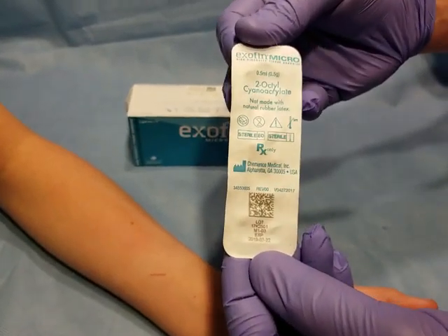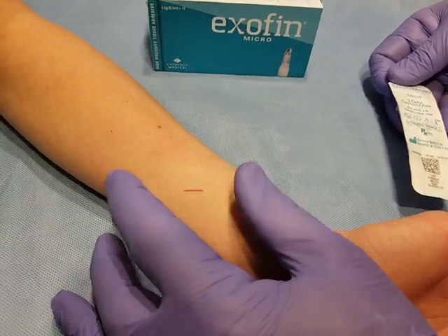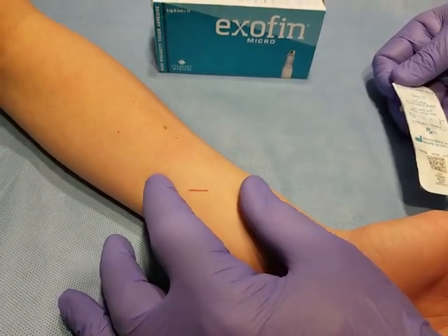Hello, this is a short tutorial for Exafen Microtissue Adhesive. What we have here is a simulated laceration approximately 10mm in length.